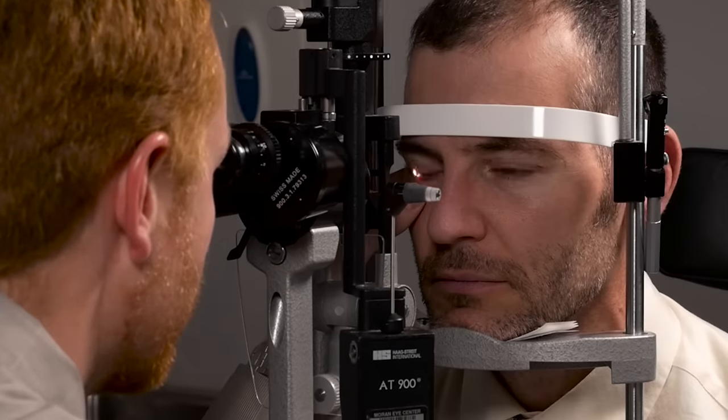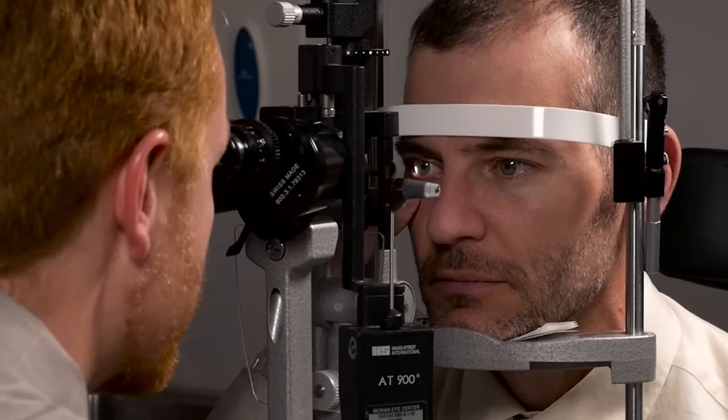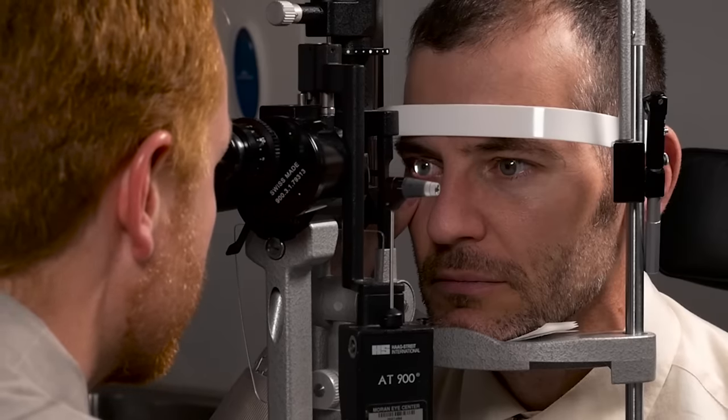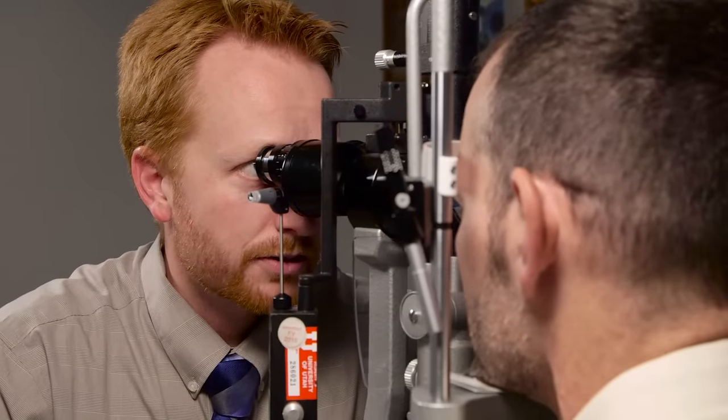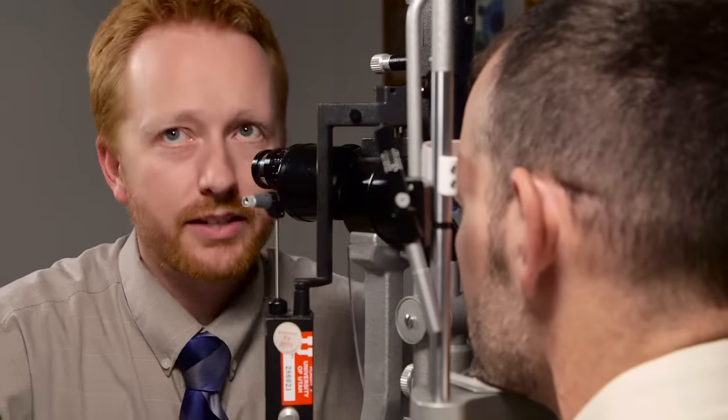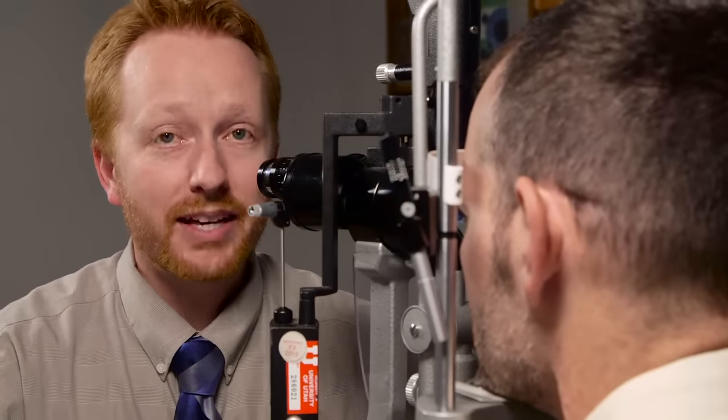Now ideally, you would like the contact lens to move a little bit, maybe 0.1 to 0.2 millimeters, but not too much, because if it's too much, then it'll be uncomfortable. Blink. Another important thing is to make sure there's full limbal coverage and that the contact lens extends beyond the limbus onto the conjunctiva and it's not rubbing against the limbus.